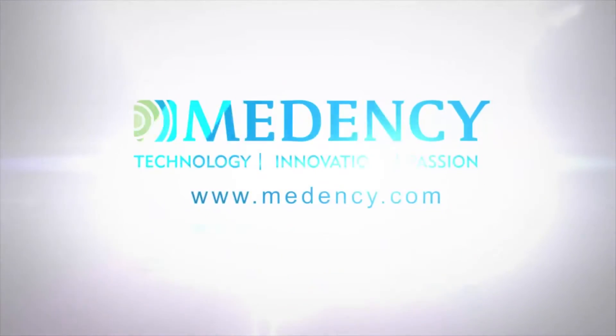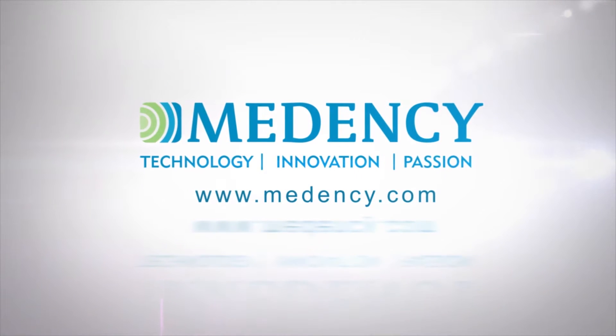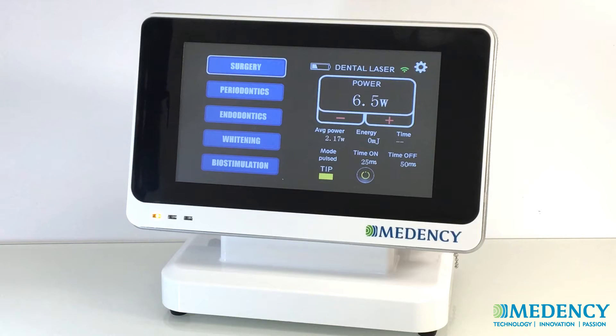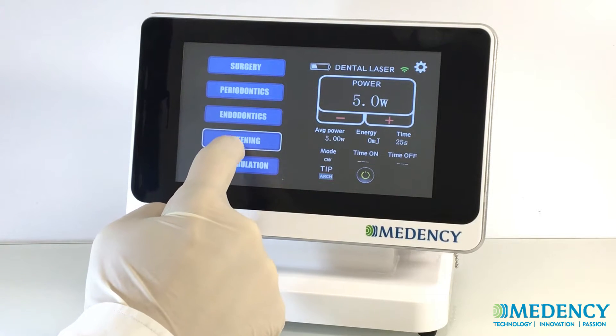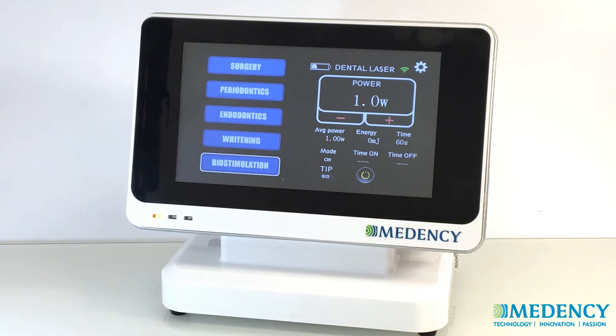Congratulations on purchasing the Primo Dental Laser System from Medincy. Primo is an extraordinary diode laser that combines periodontics, soft tissue surgery, implantology, therapy, and whitening in a single device with an easy-to-use touch screen that simplifies the steps needed to get to work regardless of which treatment type is used.